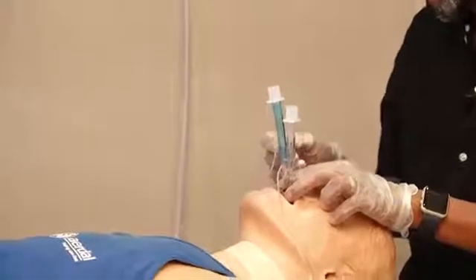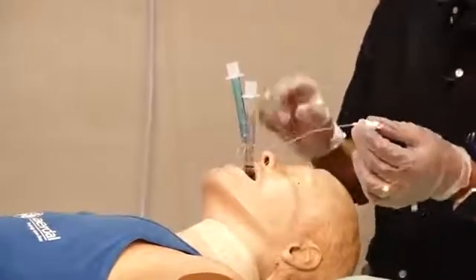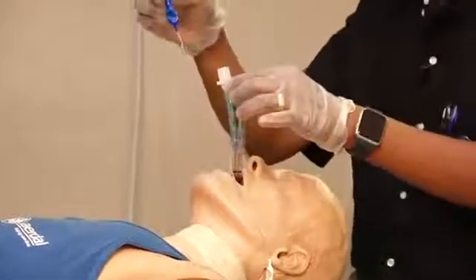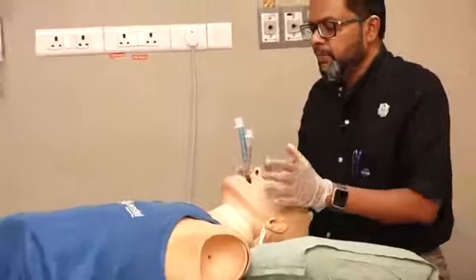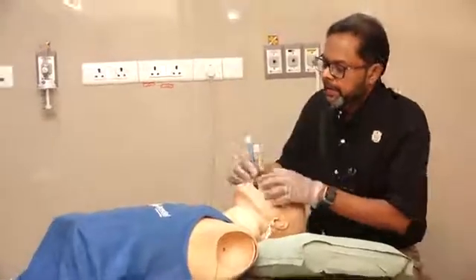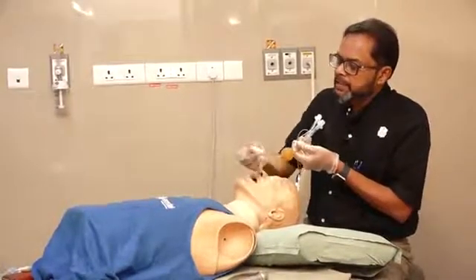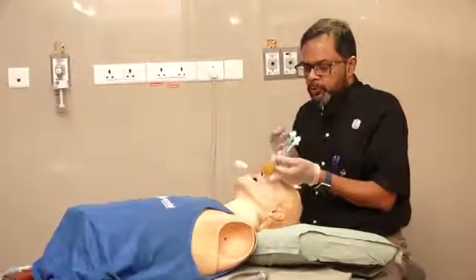After insertion, inflate both cuffs: the tracheal or esophageal cuff and the pharyngeal cuff. The volume required is 12 ml for the white one and up to 85 ml for the blue one. Once inflated, the larynx sits between the two cuffs, and the cuffs create an airtight seal around it.